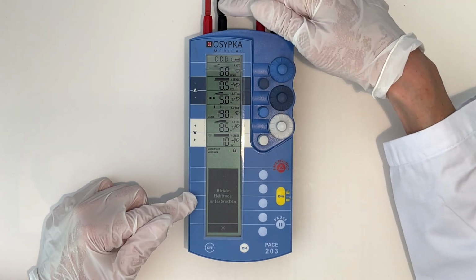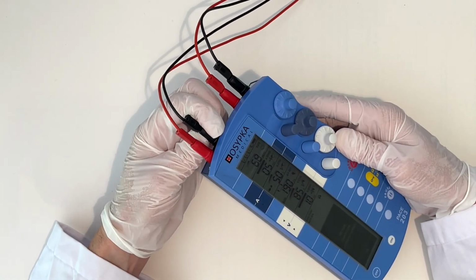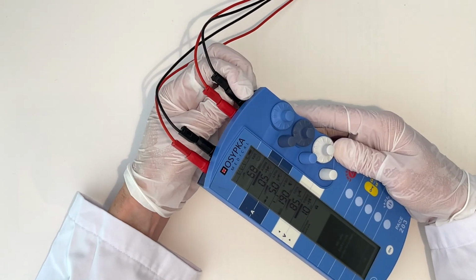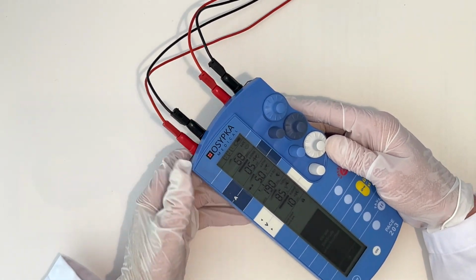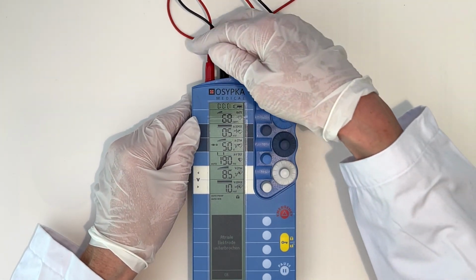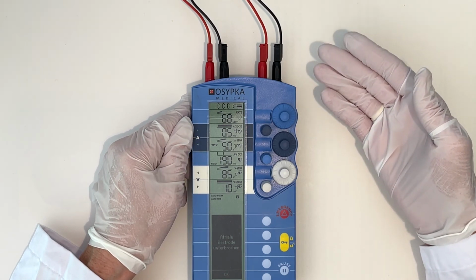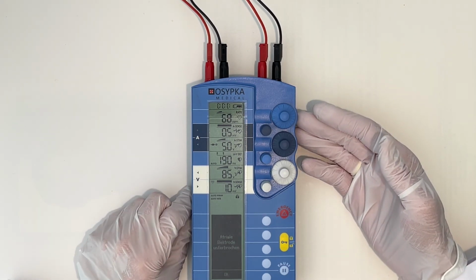Then you should check at the end of the pacer whether the plugs of the cables are securely in the connection sockets of the pacemaker. By turning the collets, you can ensure the connectors are tight. That should solve the problem. If it doesn't, check the entire length of the connections from the device along the cable to the heart wires. Follow the lead right to the heart to see if there is an interruption somewhere.